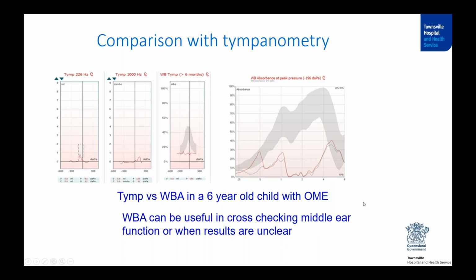When I'm describing all these results, I'm not taking wideband absorbance in isolation. It shows improved performance compared to tympanogram, but still it is just one of the tests in your whole test battery. You need to compare it with the other tests, with the case history and the other observations. Just do not depend only on the wideband absorbance. We are still not at that stage yet.